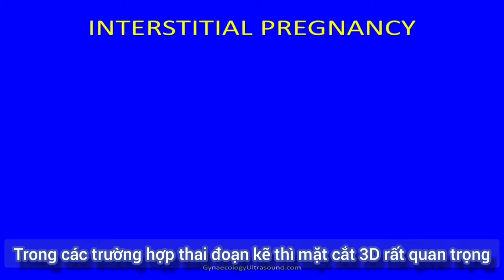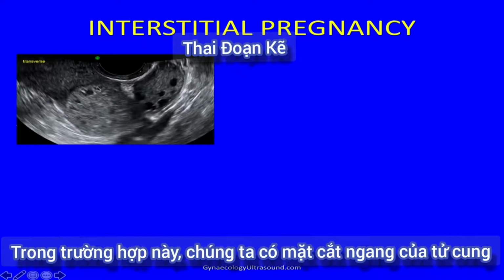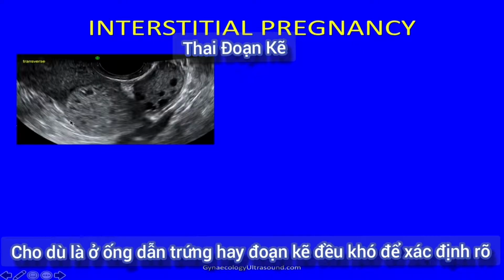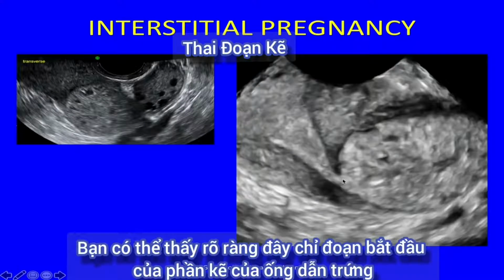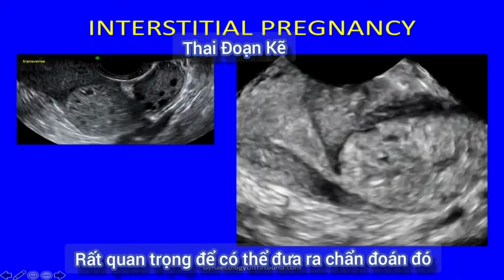In interstitial pregnancy, the 3D view is very important. In this case, there's a transverse view of the uterus, there's the ovary, and there's a pregnancy located in this position. So whether it's tubal or interstitial is difficult to be certain of. But on 3D, this is the endometrial cavity to one edge, you can clearly see that this is just the beginning of the interstitial portion of the fallopian tube, and that is exactly where this pregnancy is located. So important to be able to make that diagnosis.